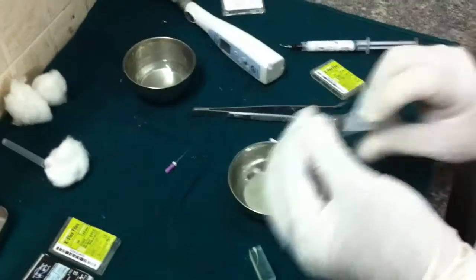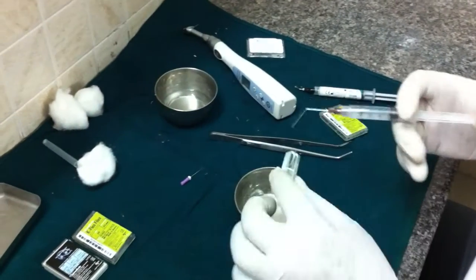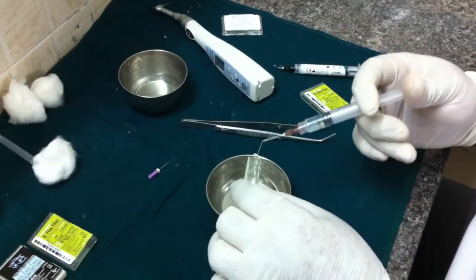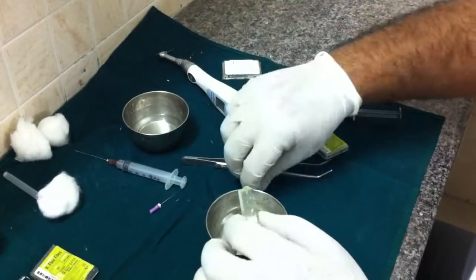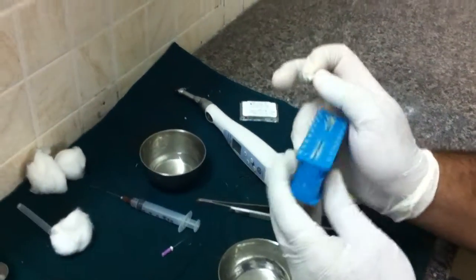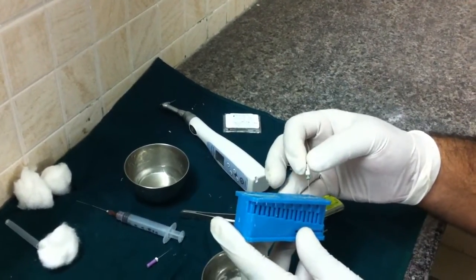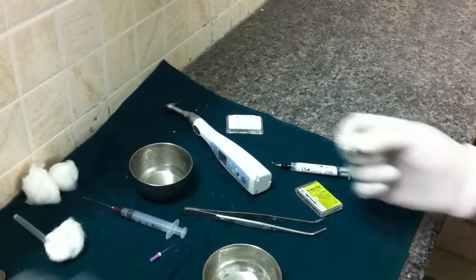Irrigate with saline. This is my working length. My working length is 17.5.